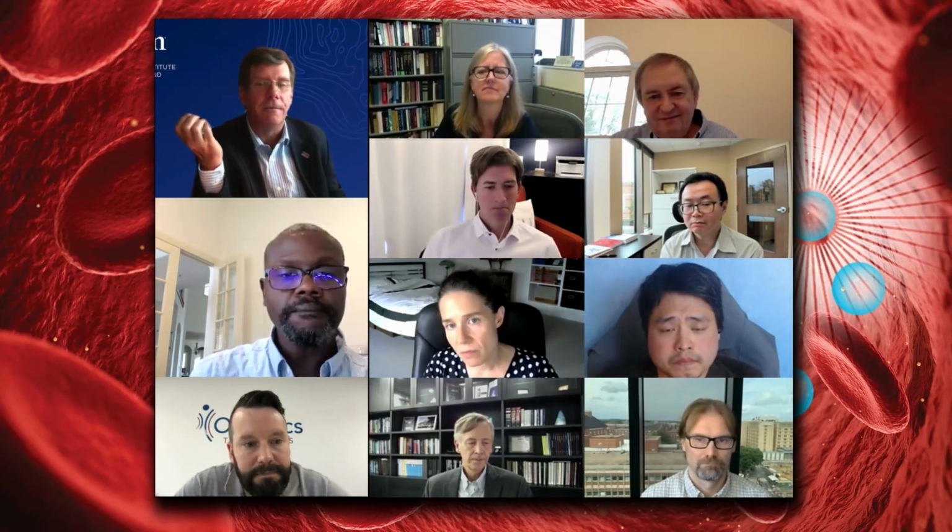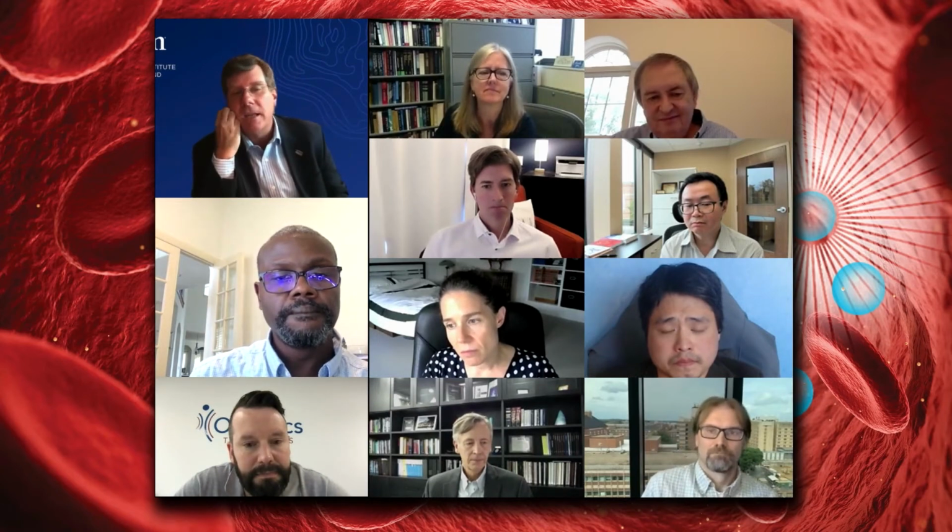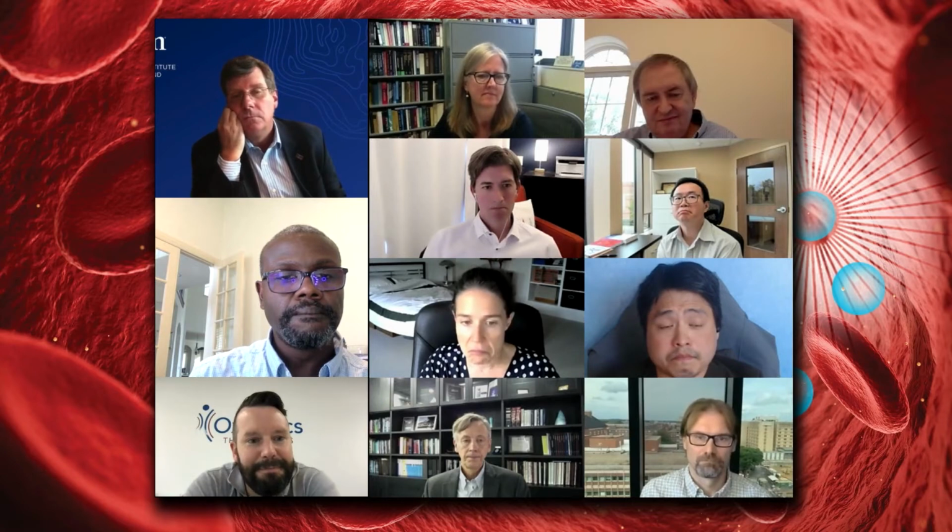So do you think it's easier or harder in the presence of, let's say, a known agent than if you're relying on endogenous cavitation nuclei? I would say yes. I think we've got a better chance of predicting what's going to happen. I guess that's going to slightly depend on the agent, though, because the more complex the agent, the more things it could possibly do. And again, not ignoring the biology, maybe with some of the stuff we've been doing recently, we've come to the conclusion that actually the primary effect is chemical and it's nothing to do with the cavitation. So yeah, I realize that just opens another can of worms.